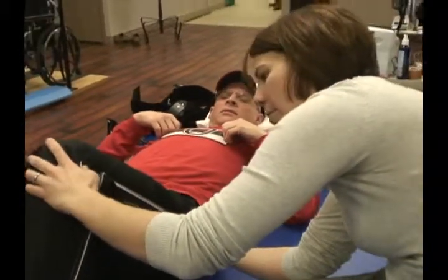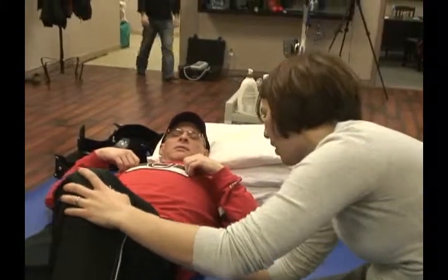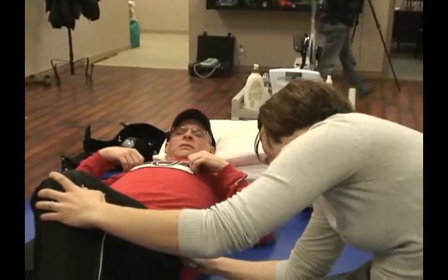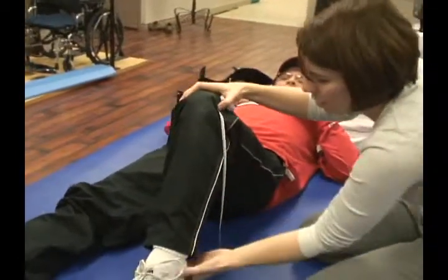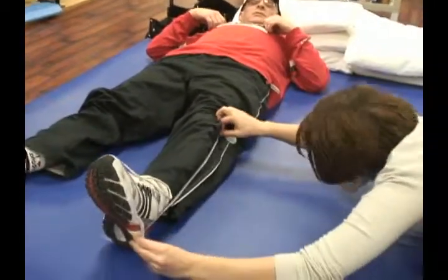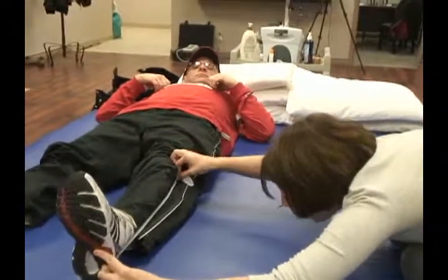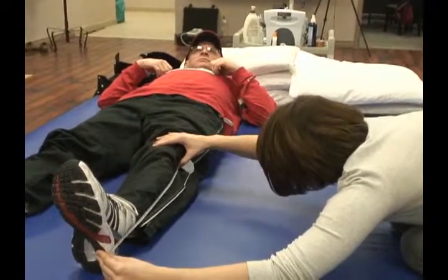And this is just to help set the length of the bars on the robotic legs. So 43 — is that what I had last night too? And 56.